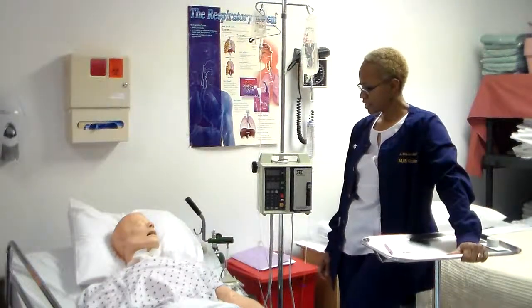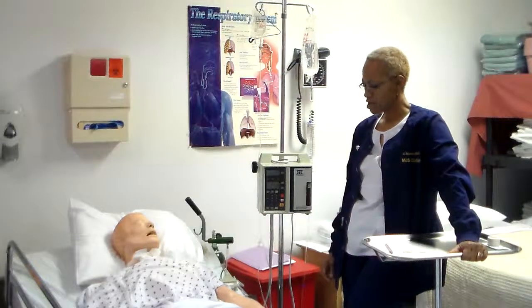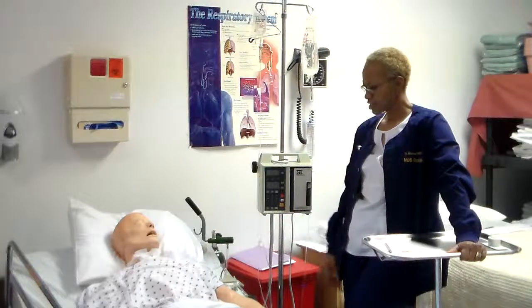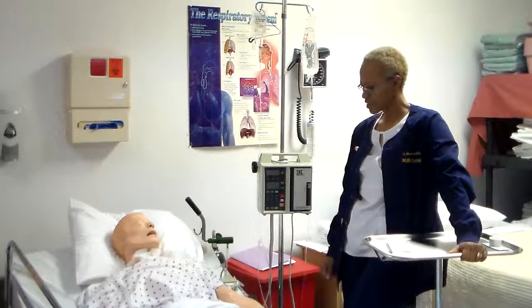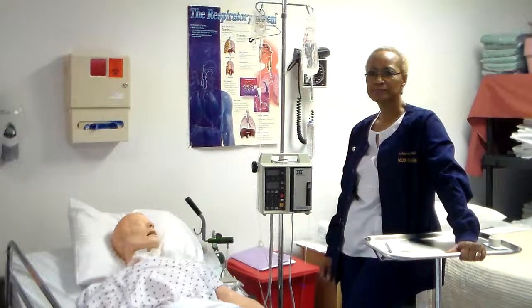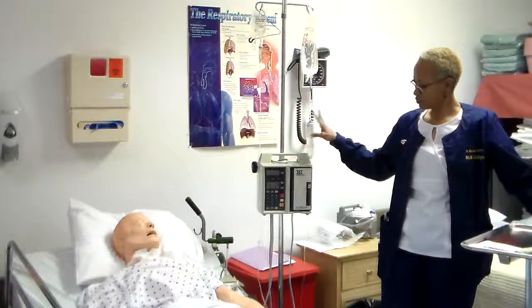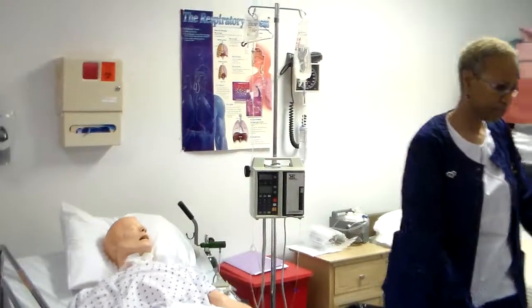Okay, so remember your medication and what it was for? Absolutely, your infection that you have on your leg. Okay, and any side effect? Good. It may cause itching, it may cause chills, it may cause whatever. Right, absolutely. Record medication, dose, route, and time administered on MAR or computer printout. Okay, I will be back in about 30 minutes. That'll be all gone, and then I'll be back in and check you. Put on your light if you have any problems. All right, have a good one.